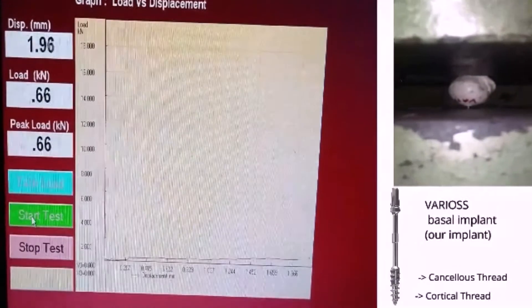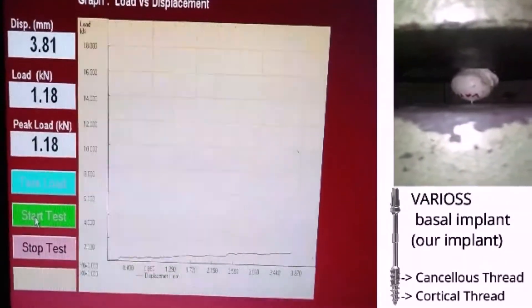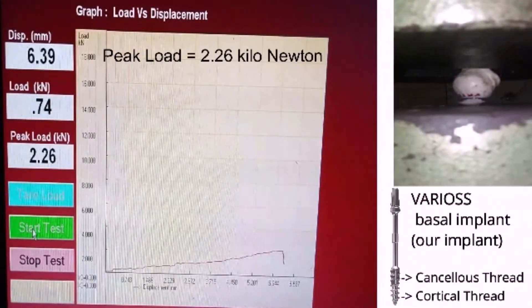Actual test on the UTM machine: Varios Basal Anchor Implant — our product — having two types of thread, cortical threads and load-sharing cancellous threads. Peak load: 2.26 kilonewton.